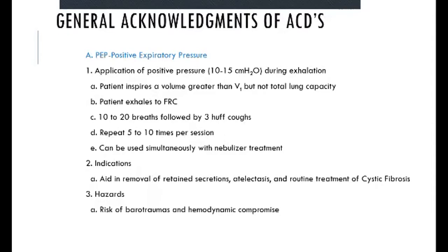Like that, because if you cough too hard, you push the secretions back down into the alveoli. If I get that good old positive pressure in there and I have the air behind the secretions, but then I tell them to cough real hard, it forces the secretions back into the alveoli. You have to first puff them up toward the larger airways and then you cough hard. When you cough hard, that is just the stuff in the large airways that you're coughing up. You can't feel the stuff in your alveoli. You have to use the device.